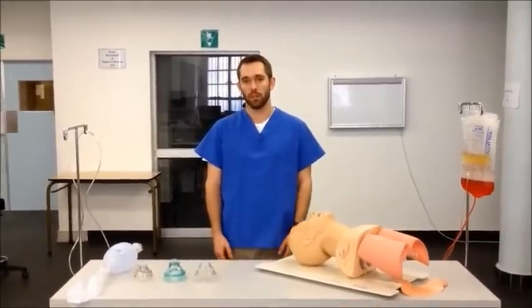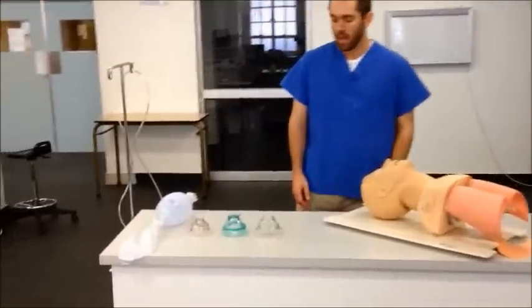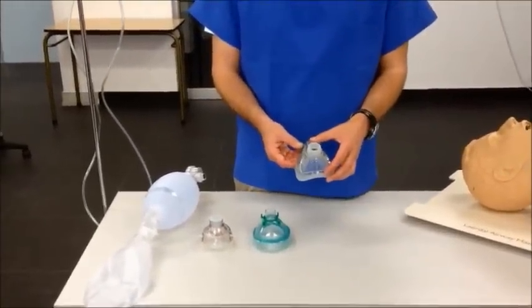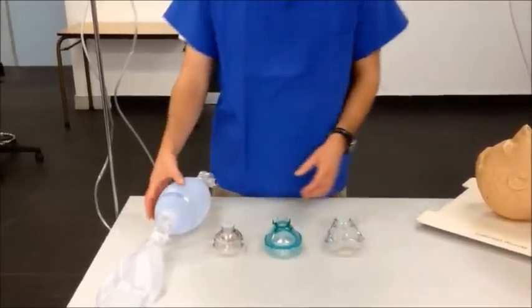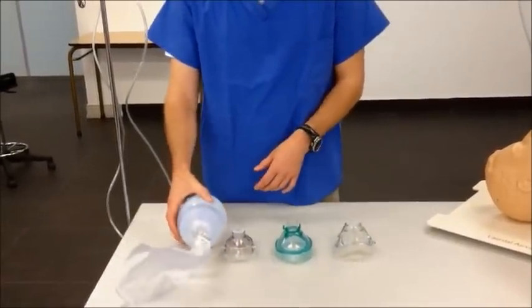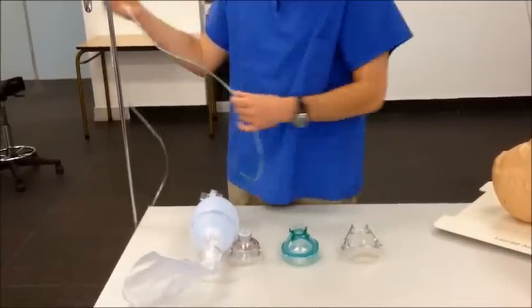The first thing we are going to look at today is our equipment. In essence, we require a device to interface with the patient's face — a mask — a device to deliver the breath, which is our self-inflating bag ventilator, and then a way to connect to wall oxygen, which would be oxygen tubing.